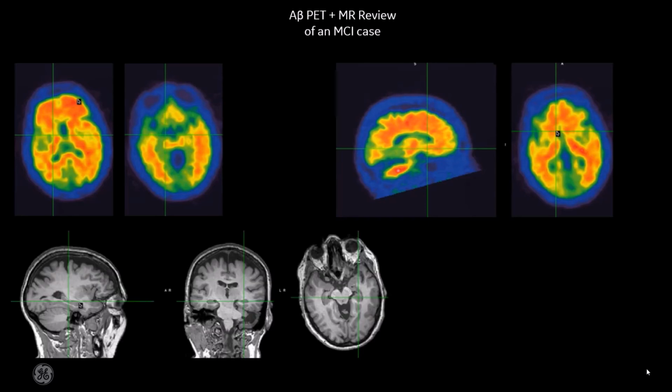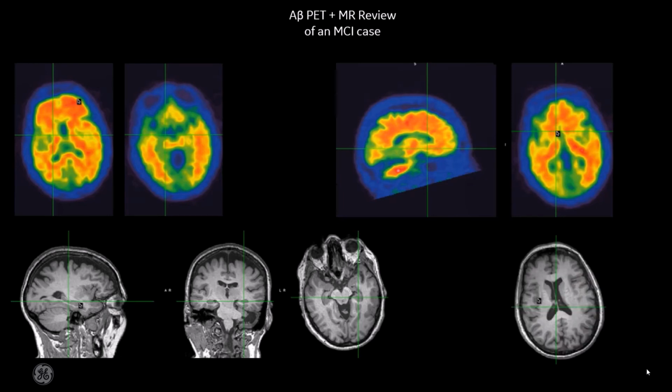If we turn to the subject's MRI and make an assessment of their neurodegeneration biomarkers, we find that the hippocampal structure, which is associated with memory formation, is mostly intact. It doesn't show a significant degree of atrophy. And the same could be said for the subject's cortical structures and their ventricles, which, whilst exhibiting a degree of enlargement, it's not to an abnormal extent for somebody of this age.